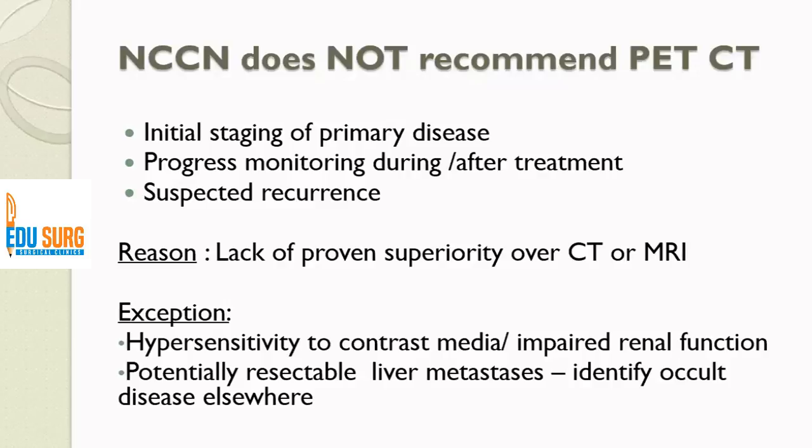The only exception NCCN has said is that if the patient for any reason cannot go for a contrast CT, due to impaired renal function or allergy to iodinated contrast media, they can undergo a non-contrast enhanced PET CT. Also, another selective indication is in limited liver lesions to identify the occult disease anywhere else in the body.